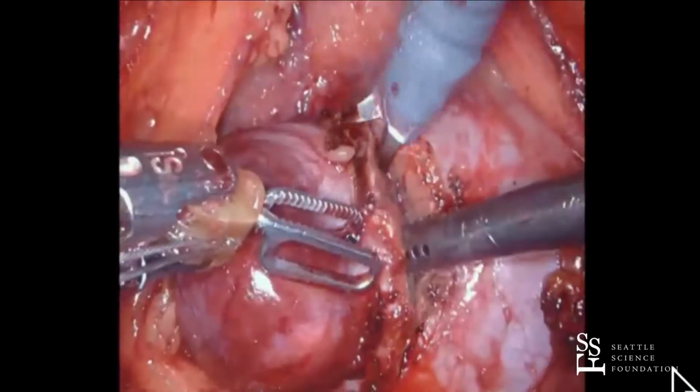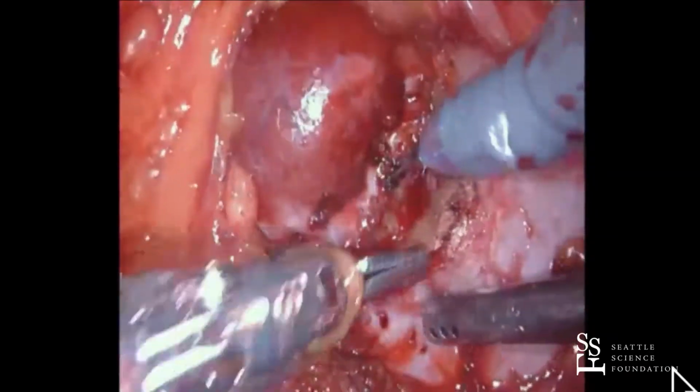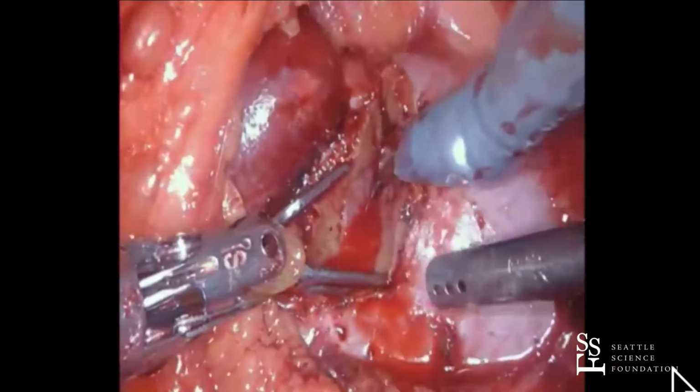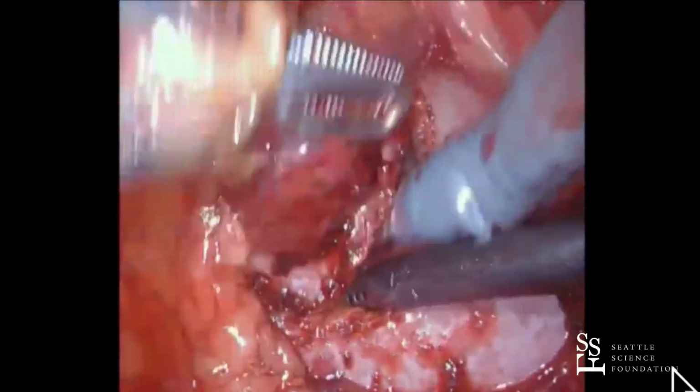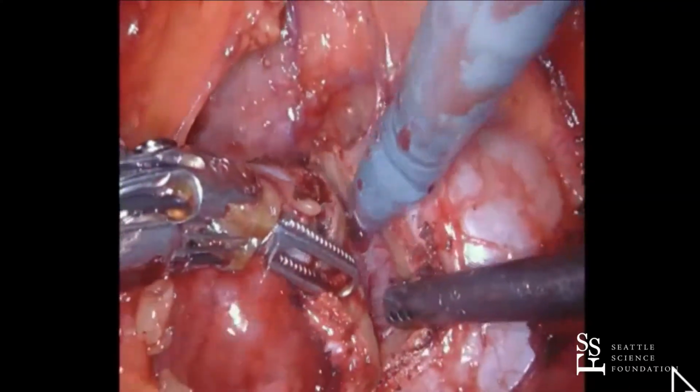Notice how he made a wide capsulotomy incision to begin. You don't want to ever work in a hole. The capsule is what's going to hold your tumor from moving. If you don't make that incision wide enough, you don't get the mobility on the tumor to get under it. That's why he made that incision wide right at the beginning, and now he's getting under it. You never want to work in a hole.